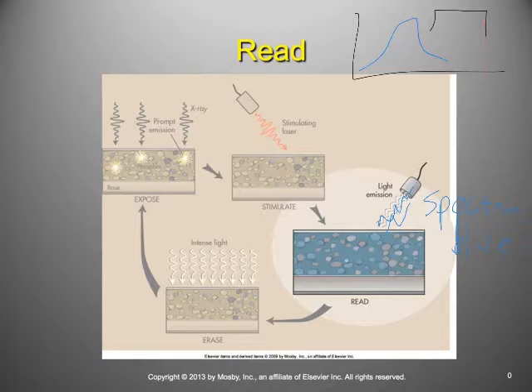And so the light is emitted and it's picked up by what might be called a photodiode or a PMT, a photomultiplier tube. It's a large glass optic piece that is able to amplify the light signal, that blue light signal, and feed it into a photodiode. What's the importance of that? It's amplified the signal, right? It's going to amplify that signal because it's a very weak signal. And in order for us to sample it, we're going to need to boost the sample up. We're going to boost the gain on it, if you will.